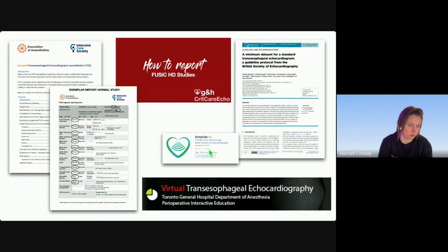And another thing, if you haven't already been told about this website, please get on it. It's the Toronto General Hospital virtual TOE software. It's free, and basically you can just go through a scan virtually. I found it really helpful when I was learning TOE.